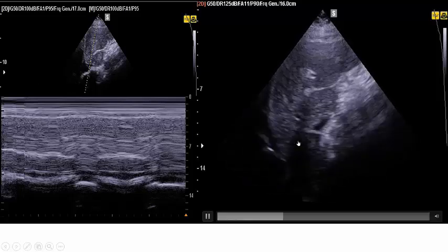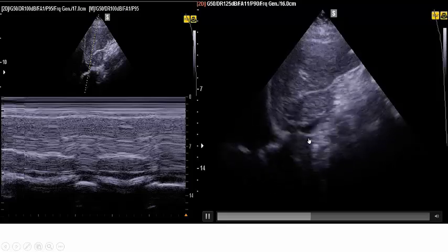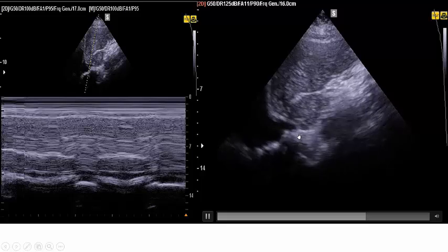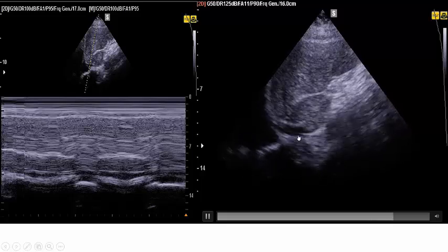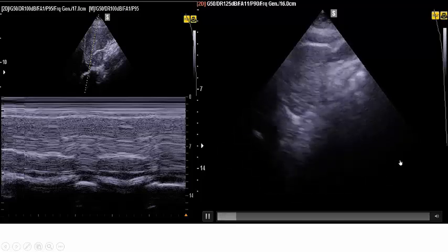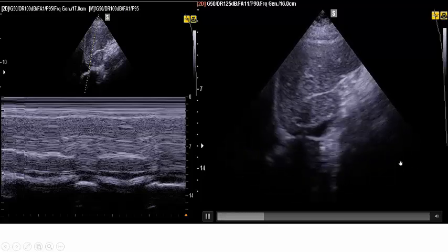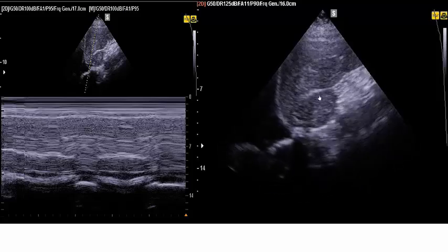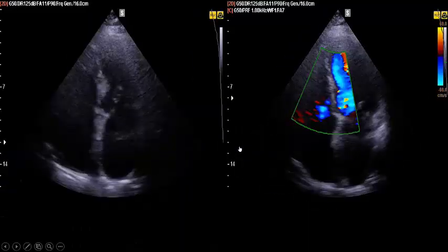Follow up by point of care ultrasound in clinic. Now the inferior vena cava is collapsing, totally collapsing. That means, according to the American Society of Echocardiography, right atrial pressure now is 3 millimeters of mercury, with a narrow, collapsing inferior vena cava.